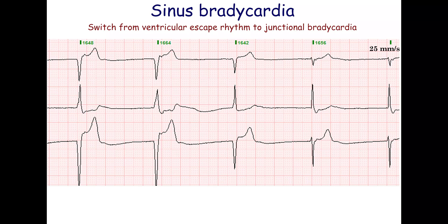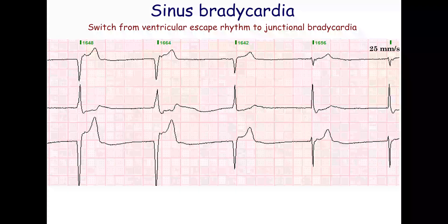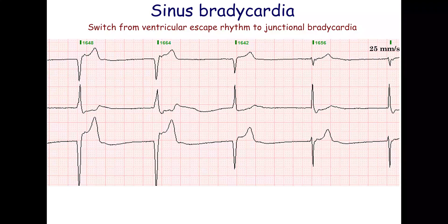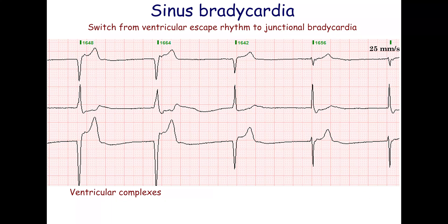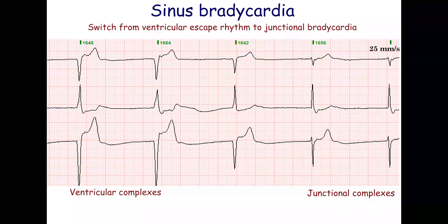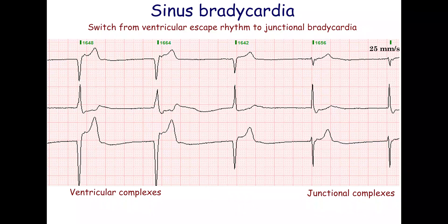This ECG shows a switch from a ventricular escape rhythm to junctional bradycardia. The rate is 36 beats per minute. The first and second QRS complexes are wide, indicating a ventricular origin. The last two QRS complexes are narrow, indicating a junctional origin. The morphology of the third QRS complex is intermediate; this is a fusion beat.